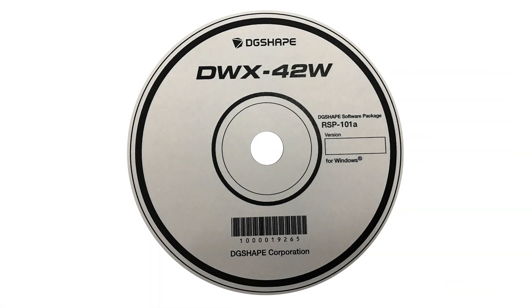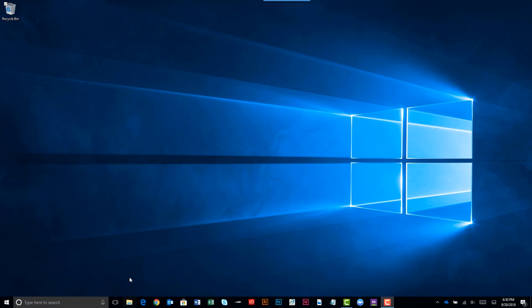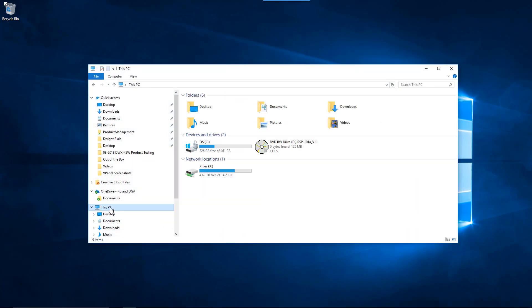To complete this step, you will need the software package CD. Open Windows Explorer and select the DVD-RW drive, then open the menu application.